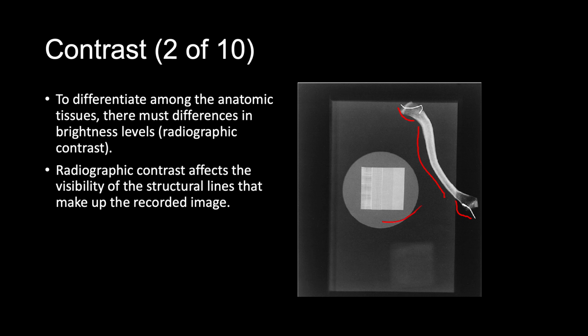And that's because of this other object here that we have also x-rayed within the same display array, and so it's not able to concentrate on one bone or one object. And so now it's having to concentrate on two different objects, and there's a lot of differences in the tissues. There's a lot of differences in the brightness.